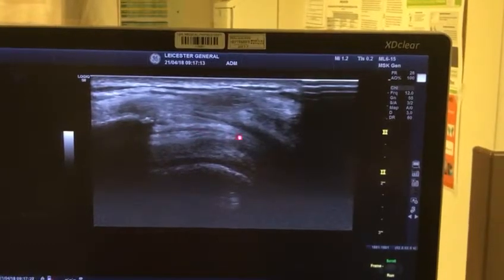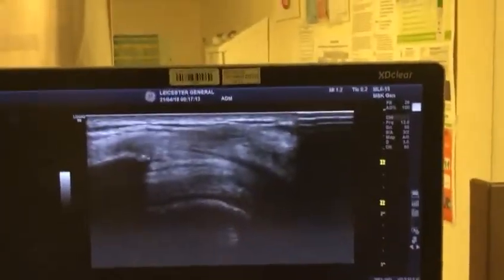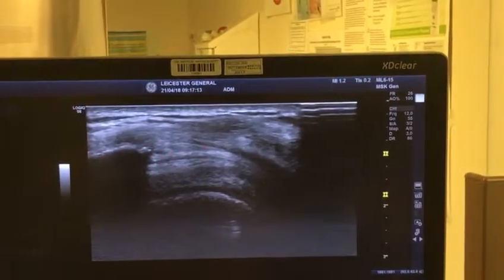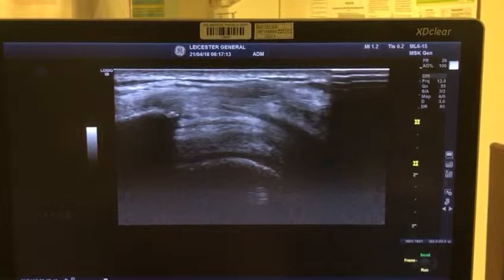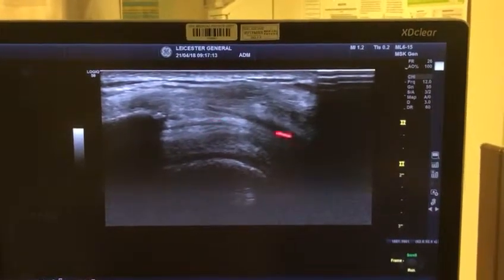The sliver of fluid you see on top is basically the bursa with the peribursal fat, and that whole muscle is deltoid. So that's why it's called subacromial — underneath the acromion — and subdeltoid — underneath the deltoid muscle. The correct anatomical term is subacromial subdeltoid bursa.